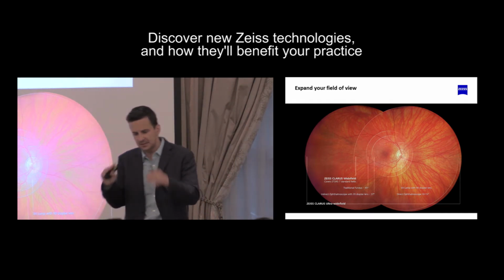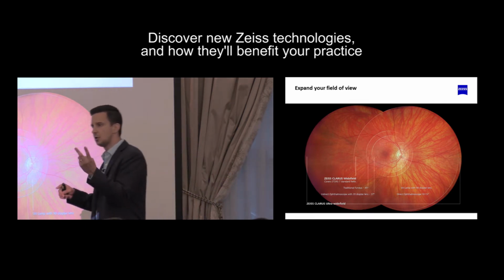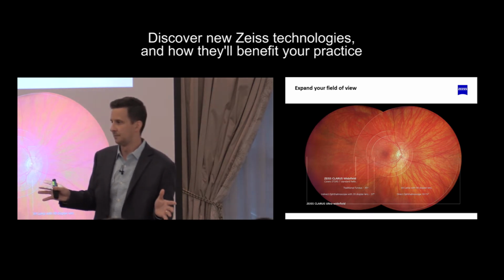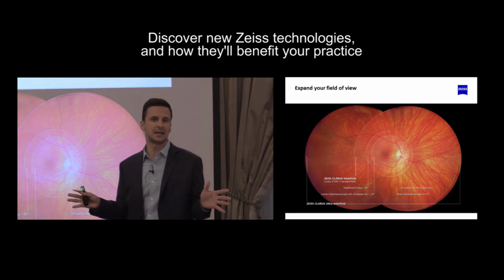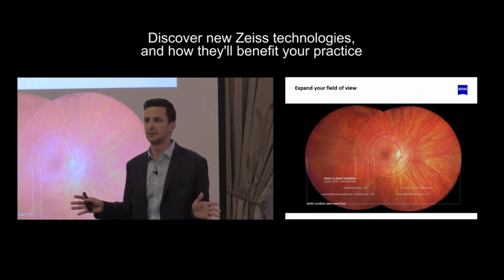I think people start to think, well, is it one image? Is it two images? What is it? It's two images. It's got a pretty bright flash that's associated with it. But when the staff use it, and they understand how to use it well, which takes about 10 patients or 20 eyes, it's like operating a slit lamp, and they're very quick on acquisition.